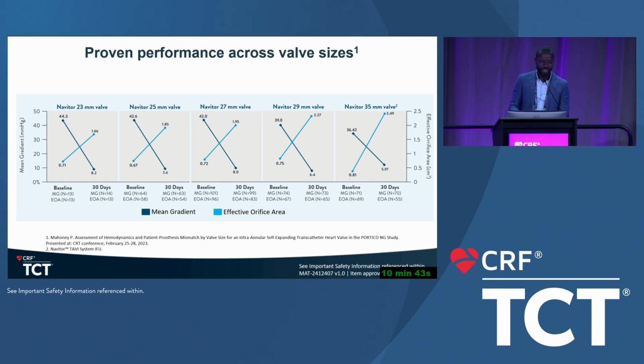Good segue. Didier, one of the things we do, and maybe people should take a picture of this, is we have these in our valve clinic for every valve. That's something we used to do before, I have to admit; now with every patient, especially if they're smaller, we look at their BSA and try to predict what PPM they're going to have, depending on which valve we put in. So we look at these charts. It's useful to have on your phone when you're thinking about valve selection.